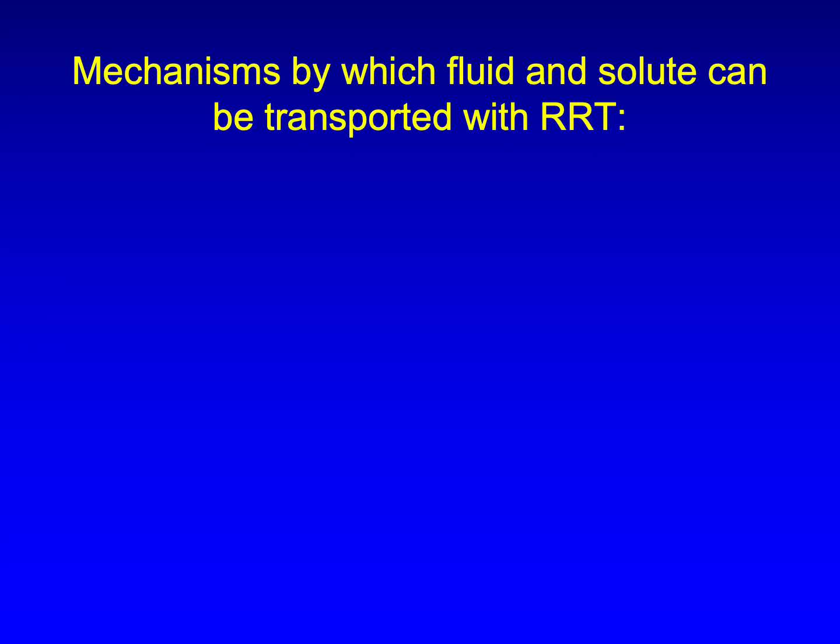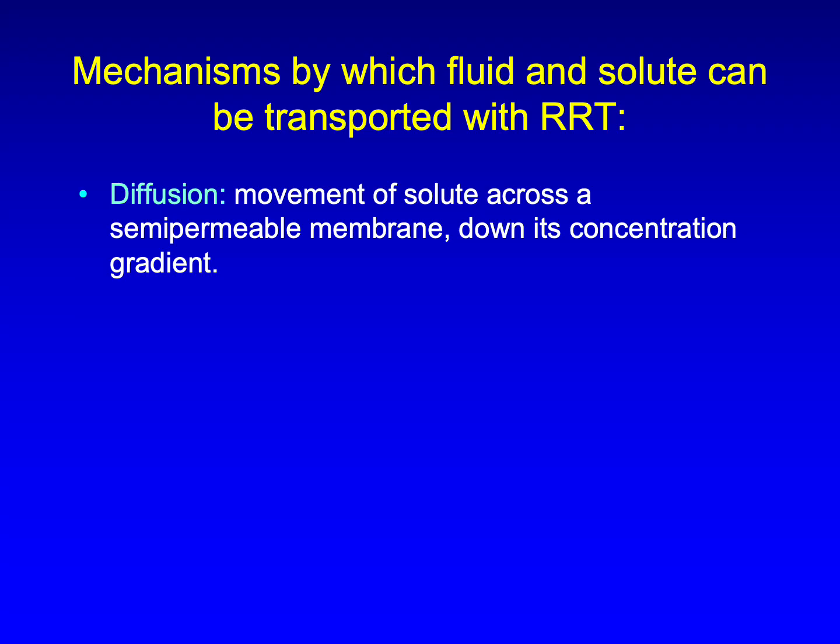So let's start with some basic terms that describe the mechanisms by which fluid and solute can be transported with renal replacement therapy. Diffusion is the movement of a solute across a semi-permeable membrane down its concentration gradient.